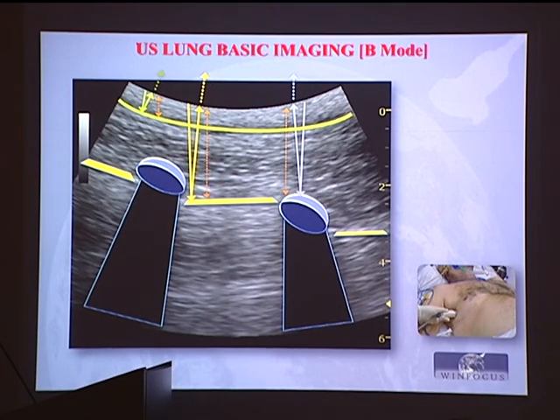That's why it's so important to be systematic. First, sonographic interpretation: hyperechoic line, hyperechoic area, hypoechoic, and then recognize the sign. And then attribute anatomical meaning and anatomopathological, physiopathological meaning to the different structures.